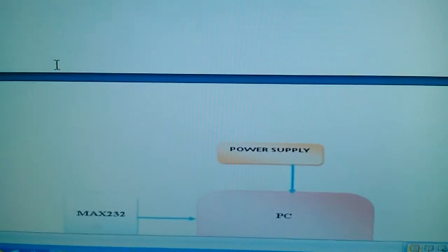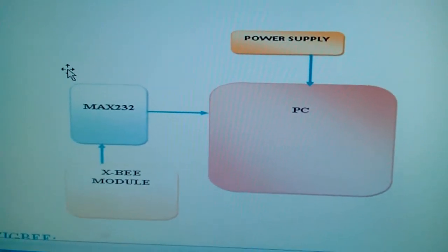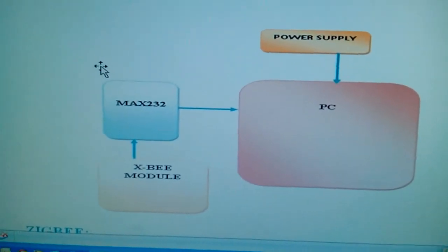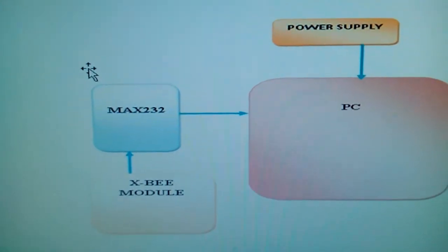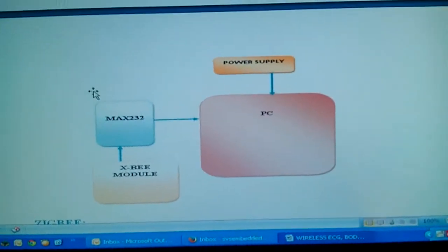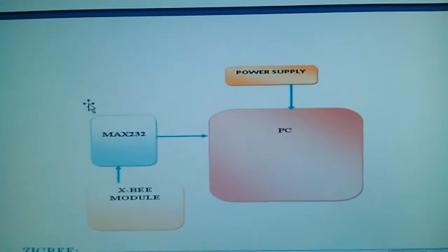Here I am using the monitoring unit. The monitoring unit is a PC. We receive the data via Zigbee and it is displayed on the PC, and we will go for LabVIEW also. As a requirement from the student, we are going for the PC.